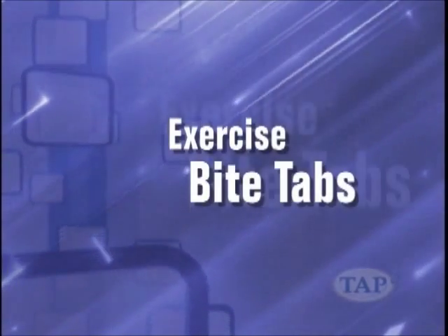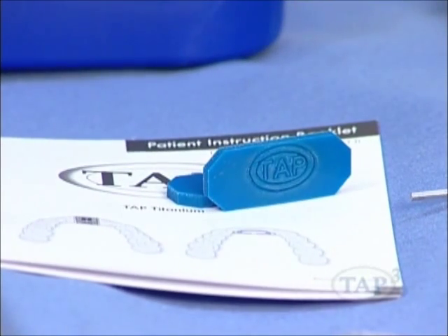Exercise bite tabs. When the lower jaw is pulled forward during the night, it may make the jaw muscles sore and temporarily changes the bite. The exercise bite tabs are intended for the patient to use each morning as an exercise tool to put the jaw back into normal bite position.